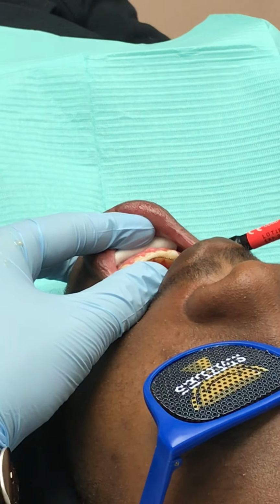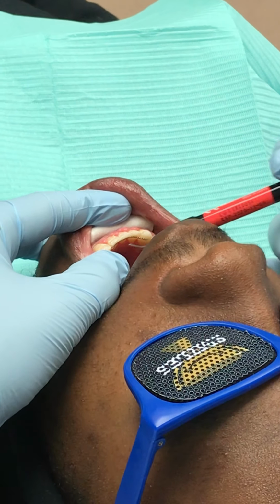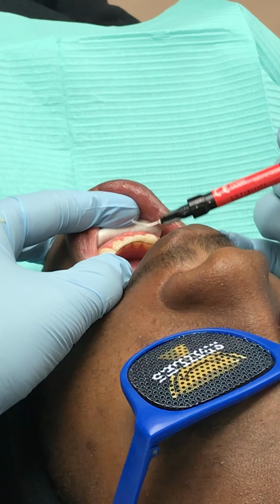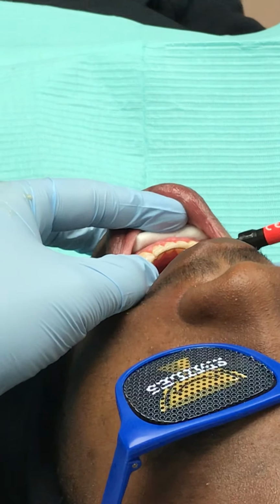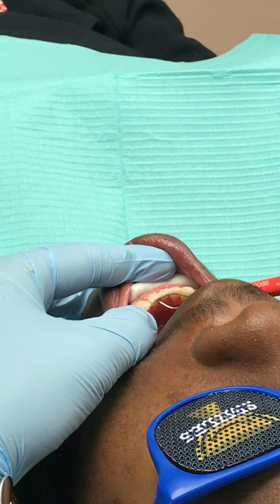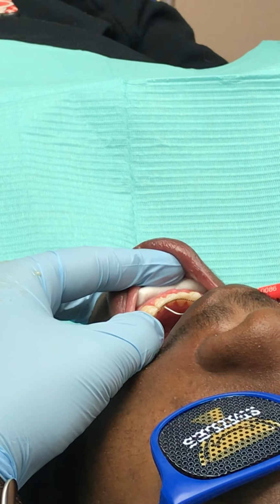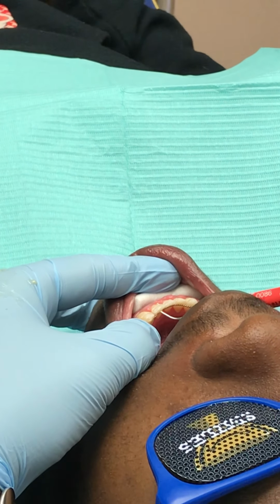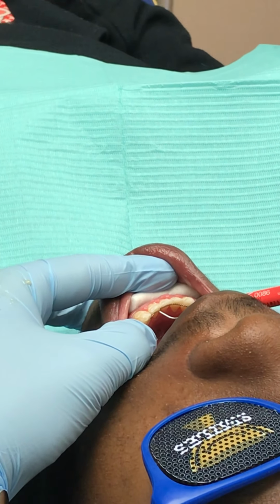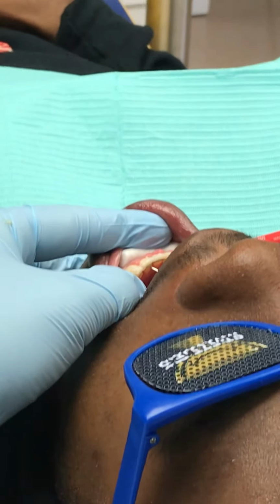Okay, so now we've got it stabilized. At this point, you don't have to worry about the wire moving at all because it's fixed on those 2 lower canines. Now it's just a matter of adding it to the rest of the incisors. Open a little bit more for me. This is an interesting case because this patient is missing a lower incisor. So typically we would be bonding this to 6 total teeth, but in this case we're only bonding it to 5. However, it really doesn't change the process much. It's just 1 less tooth to bond.